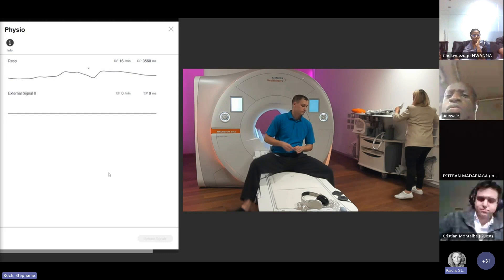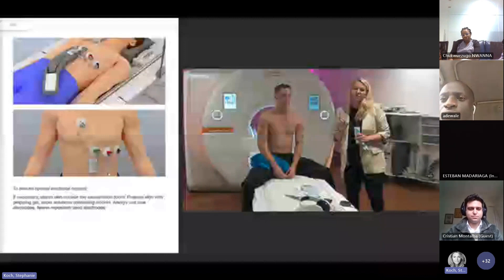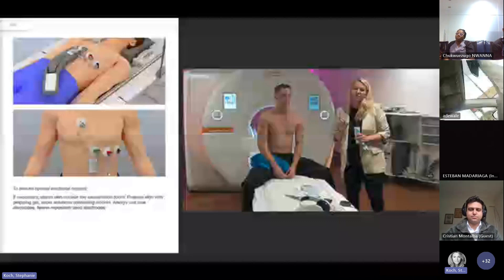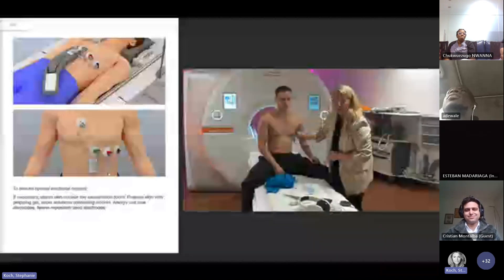Let me get a little closer so you can see the image. Here we have the patient positioning - one part goes here, and also here. I prep the skin first so it's not fatty or oily, so we have a clean skin. During summertime it can be a little bit sweaty, or maybe patients have applied body cream. It's really good to have a well-prepared skin for a perfect connection. Some skins are a little bit sensitive, so sometimes a little bit of soap with water is also a perfect fit.